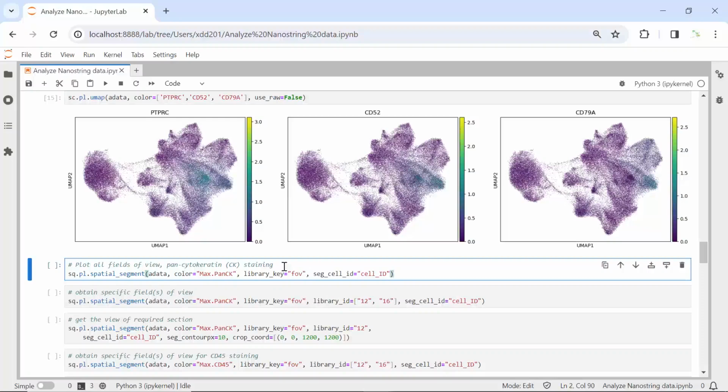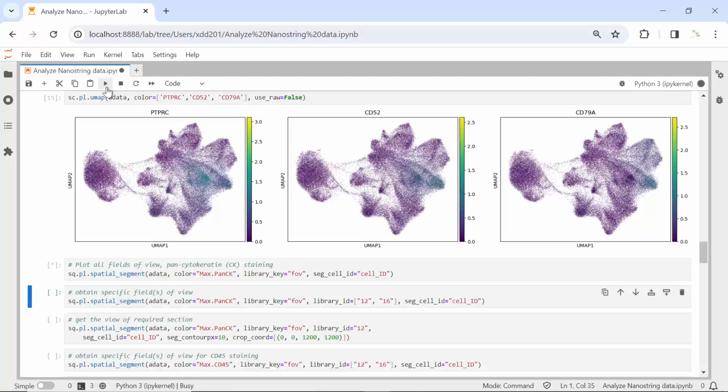Because in this dataset, they used 4 antibodies and performed the immunohistochemistry analysis. The immunostaining data can help separate the individual cells. Then we will generate more accurate data for the cell segmentation. As I showed you in the folder for the immunostaining, the best staining in this dataset is for the pan-cytokeratin antibody. We can use the staining result for the pan-cytokeratin antibody to visualize all the images. In total, we have 30 images in this dataset. Because we are going to plot 30 images, it will take time to run this step.